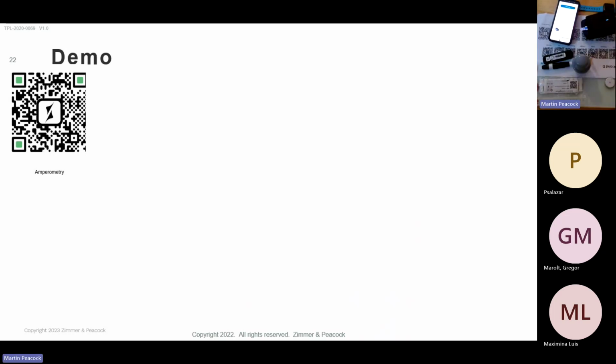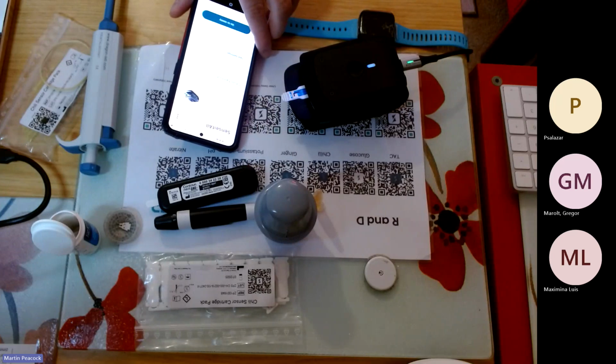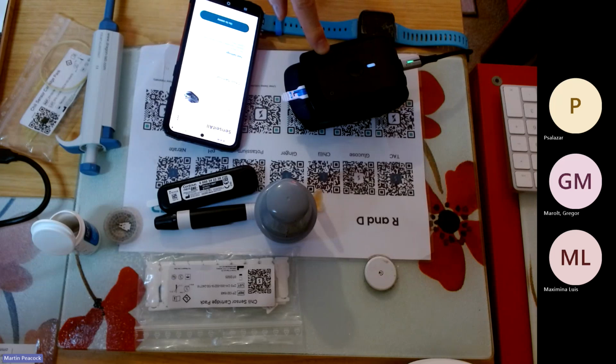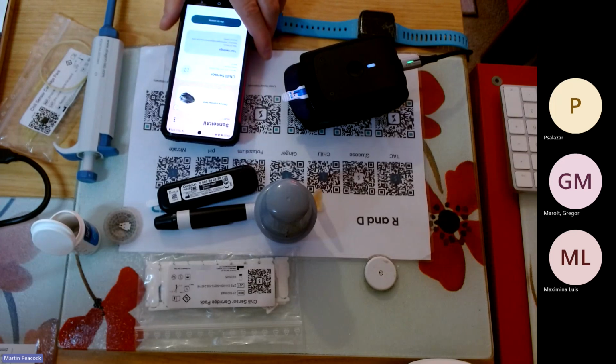This app is in Bluetooth connection, in this case, with this particular bit of hardware. This will become significant in a minute, because this app called Sense It All is in Bluetooth connection with the hardware, and the hardware, it's really a potentiostat, knows what to do because of the app. I'll go a bit quicker because one of the guys online today has seen this before, and I'm mindful of that. So now let me share my screen back with you for a second.